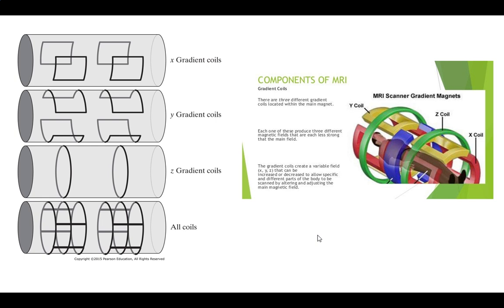If it is the same frequency as a particular spot in your body, caused by the Larmor frequency of that gradient, when they're the same, you'll get a resonance peak. Boom, that's where everything will move. The other ones are not resonant and they'll just die off. So in essence, by setting these, you can just kick a single slice, and that is the only slice doing anything.